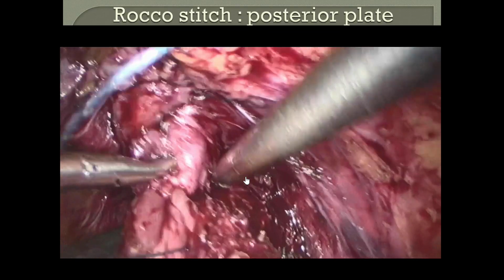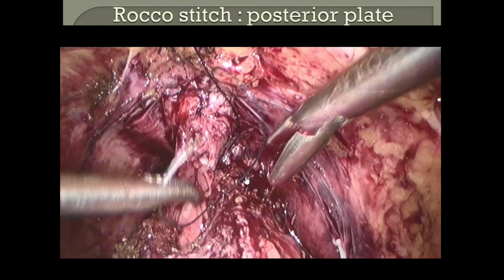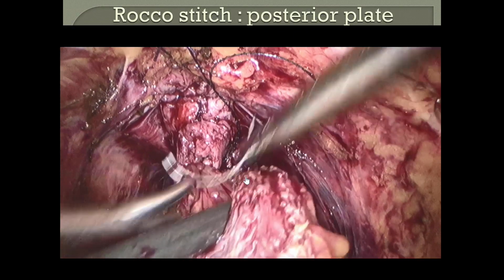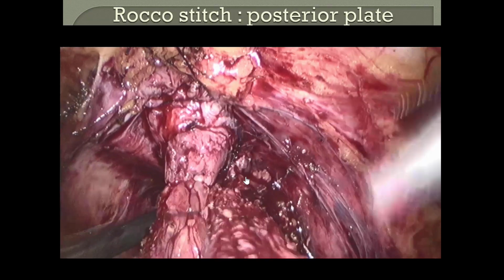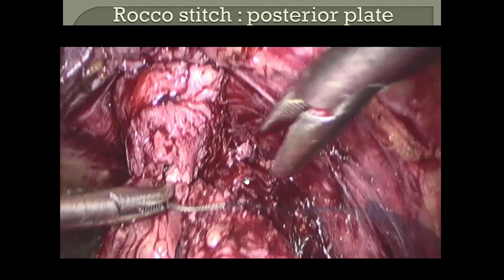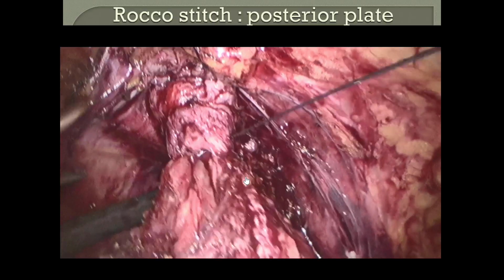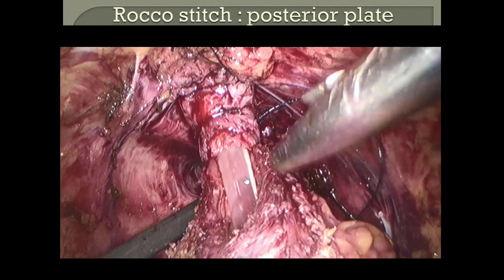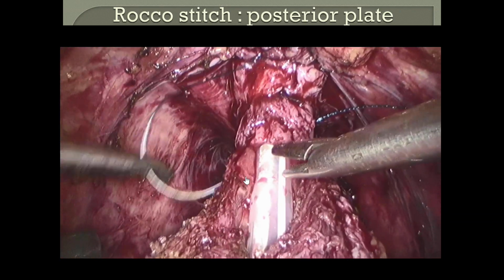So for me, the Rocco stitch does not give better results of continence, but I think it helps to have a solidity of the anastomosis, and especially if you have, for example, sometimes a hematoma. With the Rocco stitch, it will help to avoid a rupture, because the hematoma will push posteriorly, and with the Rocco stitch, the hematoma will go laterally. So you see, it's the same technique, same thing, and then we'll finish.